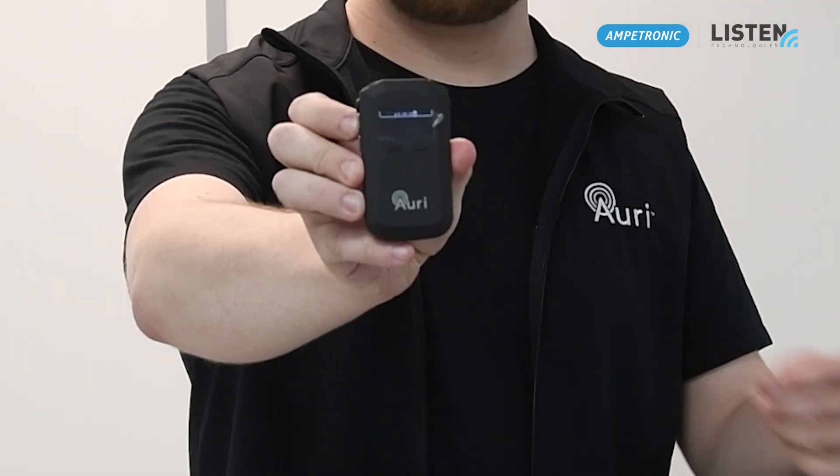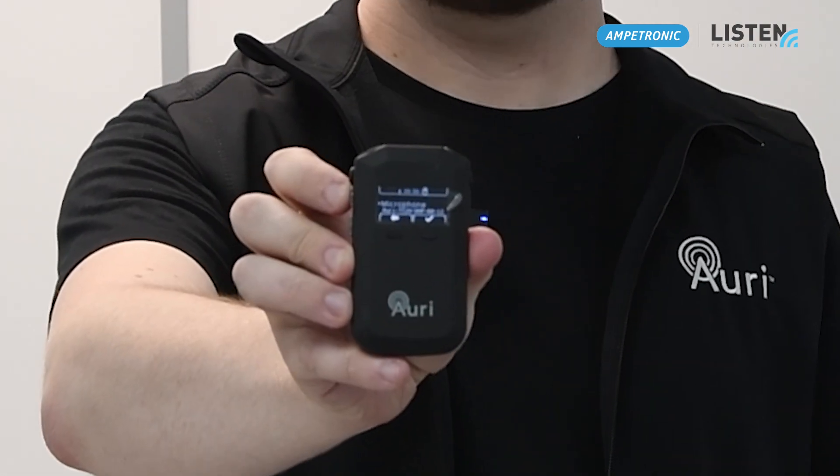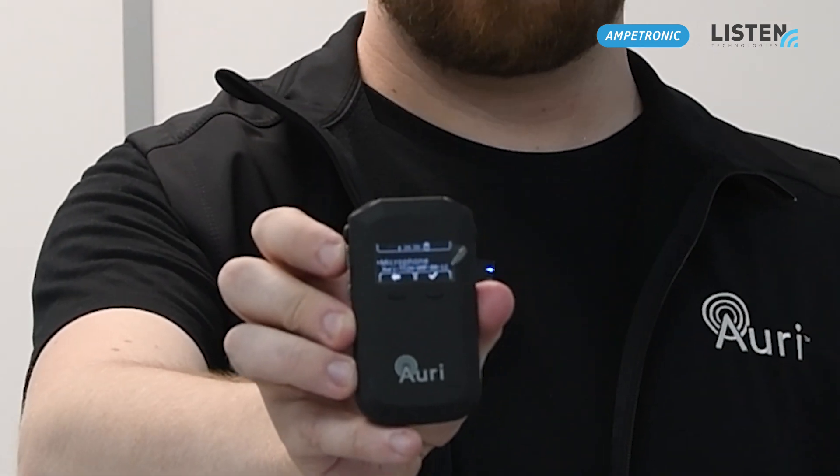Once the receivers are fully charged, take them out of the dock and you'll see that they will boot up into the Auri splash screen. It'll then scan for any available AuraCast signals and you should be able to see two channels: microphone and media player.